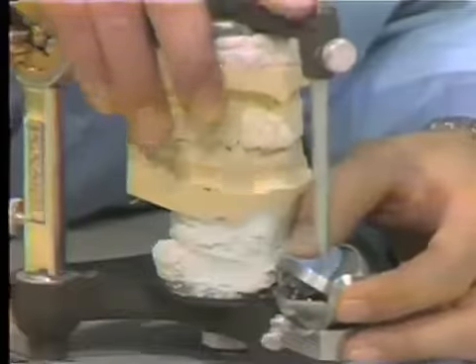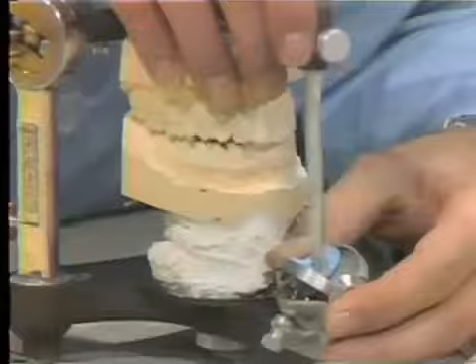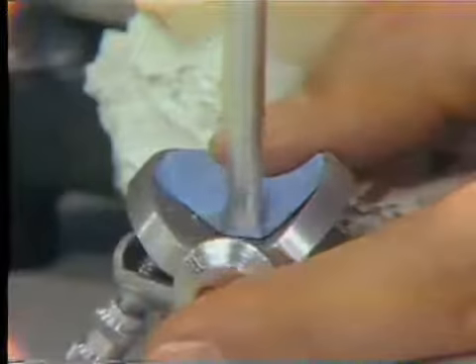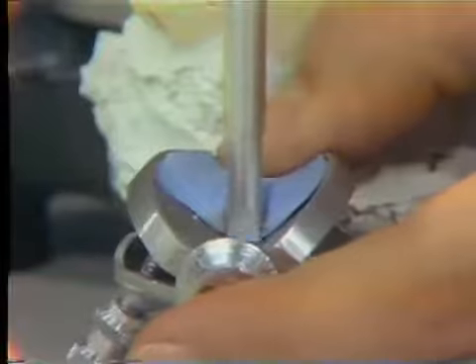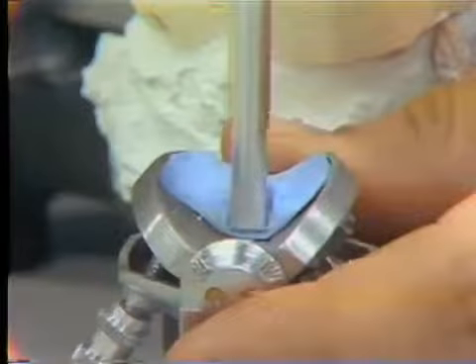Now we're going to also make the lateral excursions to make sure we cut off any acrylic that is in front of our guidance. But we're actually molding this acrylic with the incisal pin. It's now becoming set. But you can see I can make this protrusive excursion.